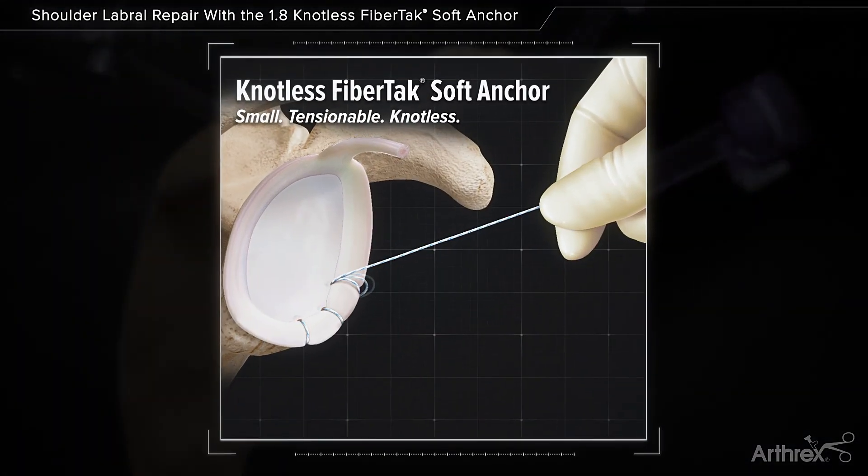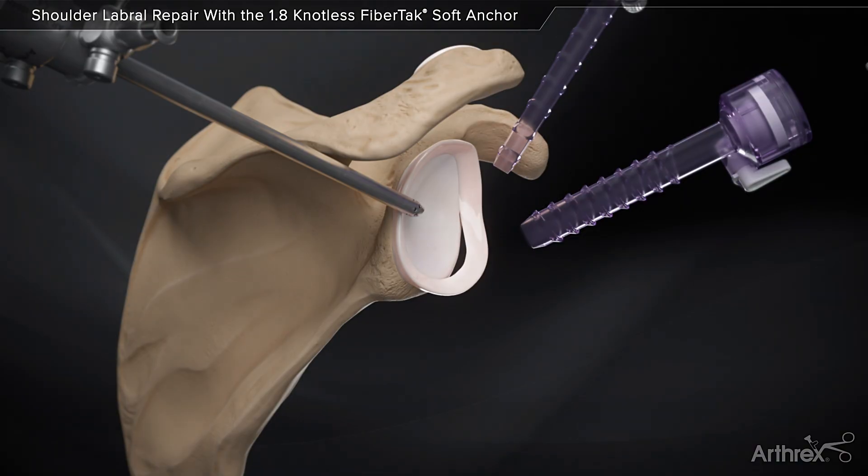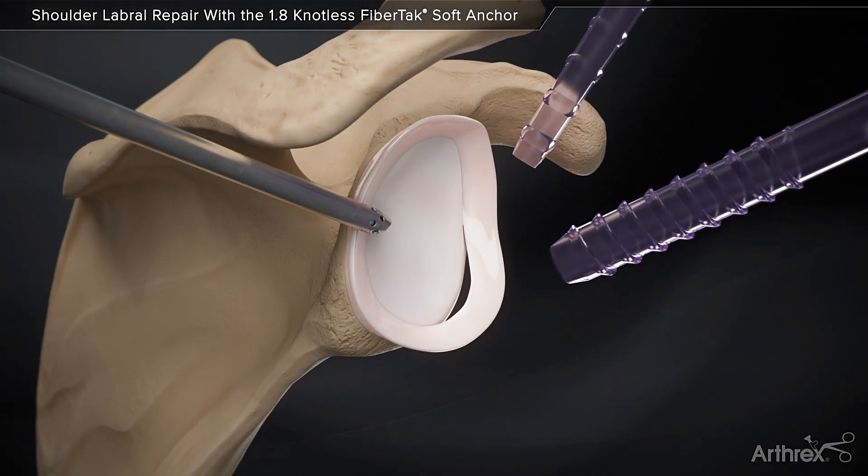The Arthrex Knotless FibreTac Soft Suture Anchor is designed with the unique tensionable knotless technology, allowing the user the ability to control and tension the repair under direct visualization.